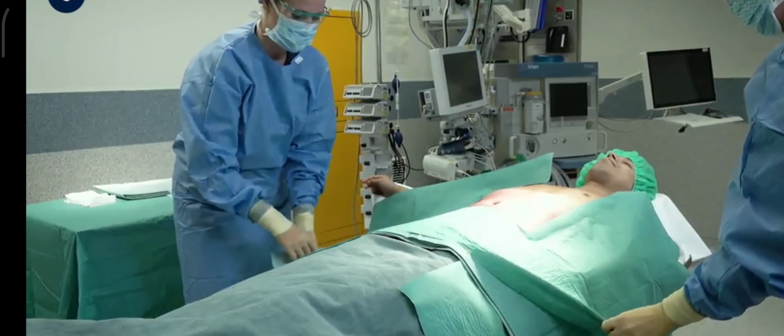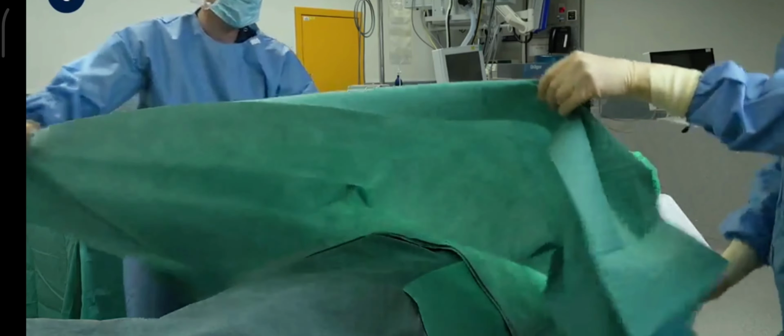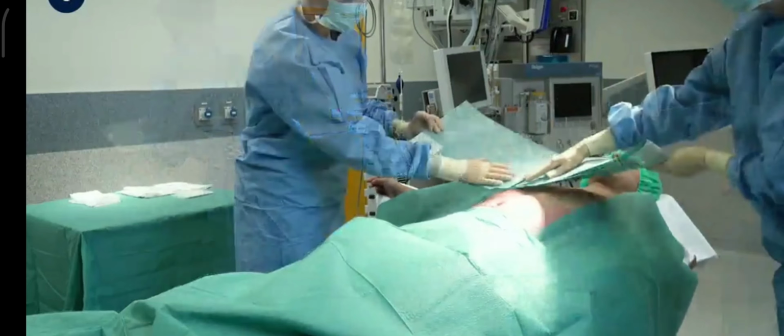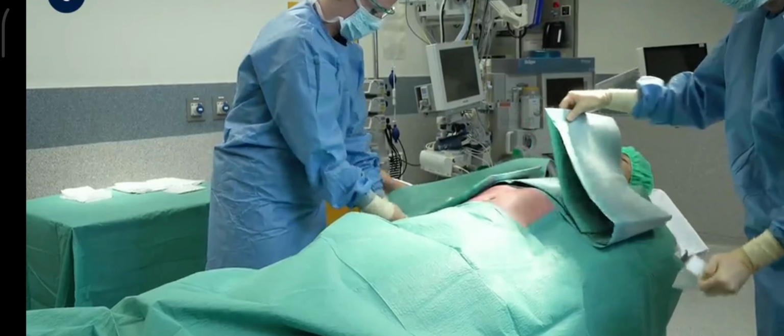This larger drape is then unfolded, extending the sterile field. Another large drape is used to perform the same action, and completes the creation of the square draping configuration.